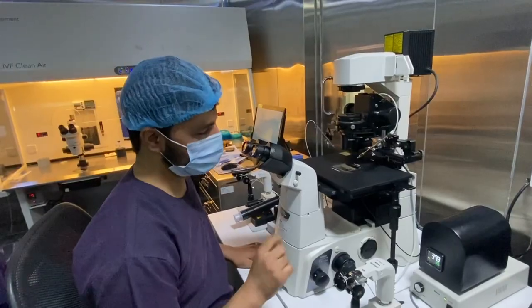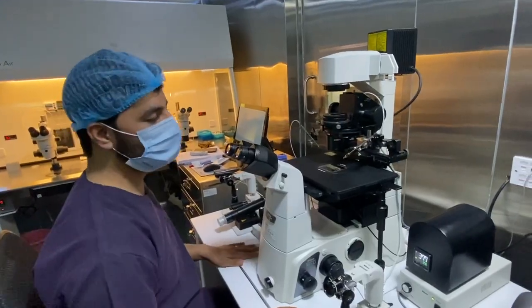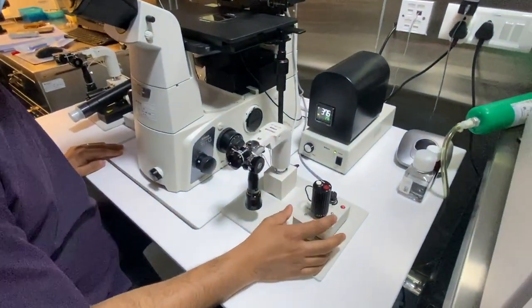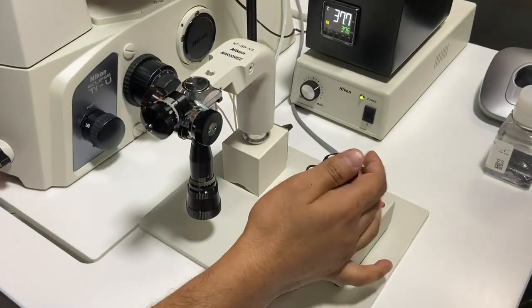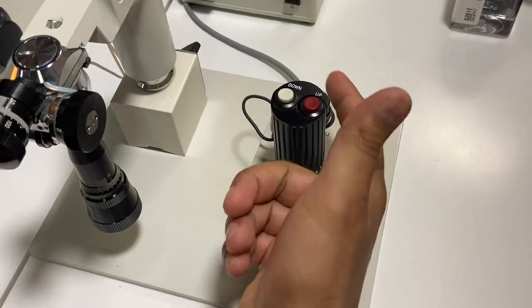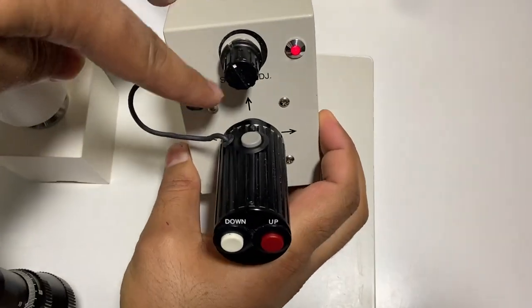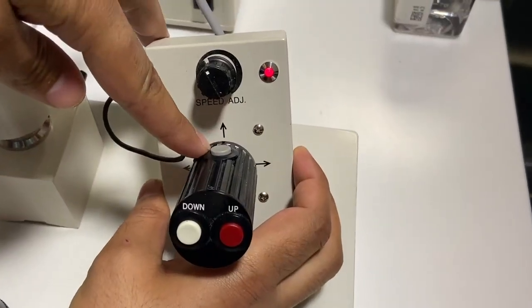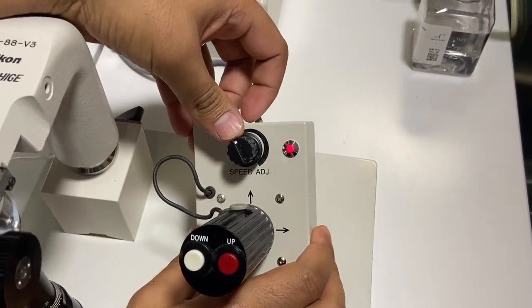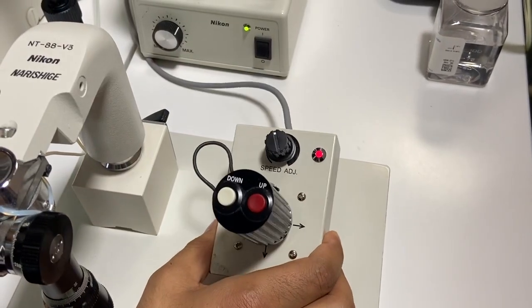I have done a little bit of up and down to the ICSI so that you can check how to align it properly. We will first start with our joystick. You can see there is the x-axis, one up, one down, towards the left, towards the right, and towards yourself and the other direction as well. There is one more button: if you want to do everything in a hurry, you press it and the speed increases. There is also a button for speed adjustment, which we have kept almost neutral, not too high and not too low.